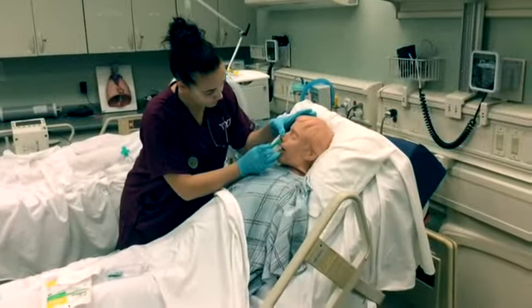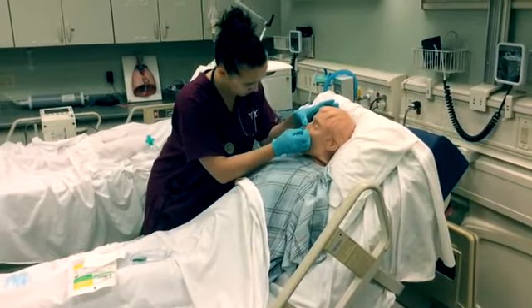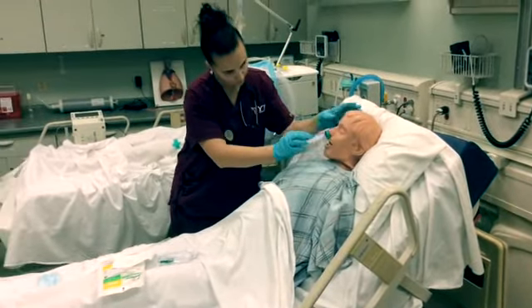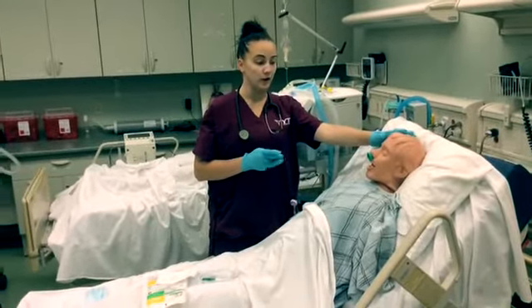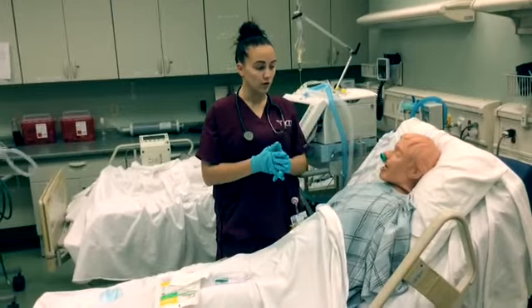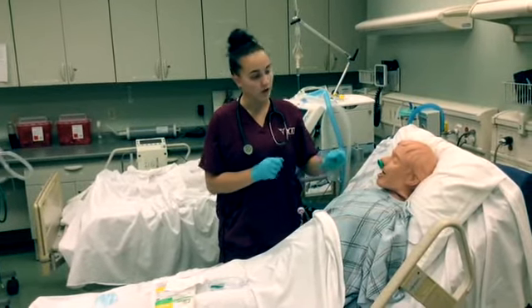We're going to insert. We use the nasopharyngeal airway for patients who can be conscious. You do not have to be unconscious to use this procedure.